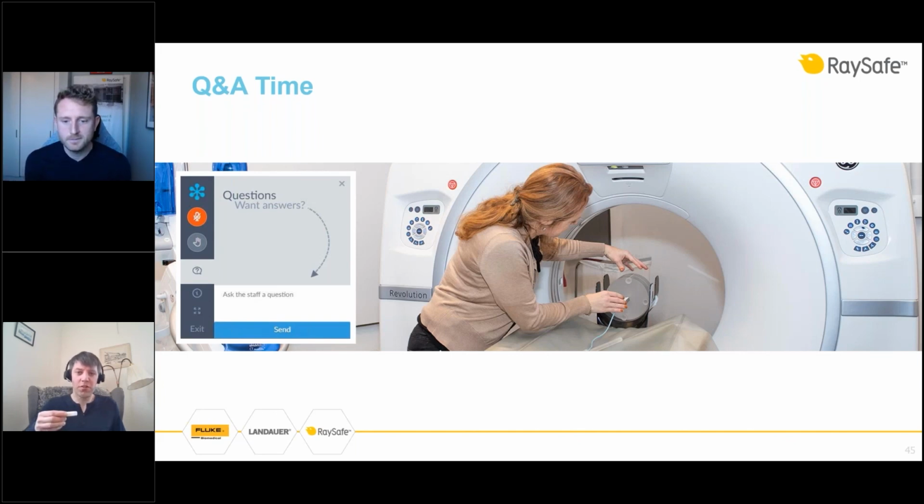But you need to use our RF sensor to get the kV on a CT machine. Yes, and if you want to measure kV, you need to make sure that the tube doesn't rotate, because the RF sensor is only sensitive to radiation coming from above. So you need to make sure that you have locked the tube in the 12 o'clock position, which you can usually do by taking a scout image. Or if you're able to go into service mode, which I guess most of you aren't, but if you are, then you can also do it that way.